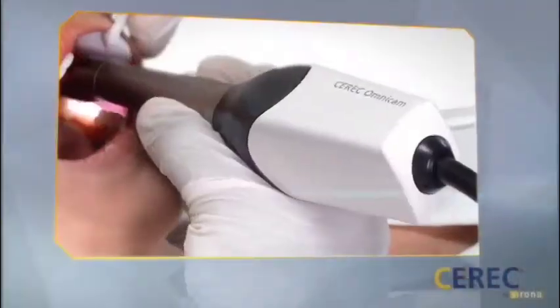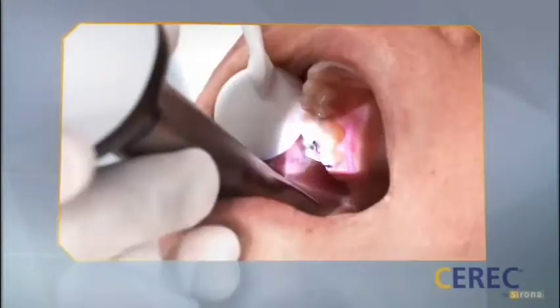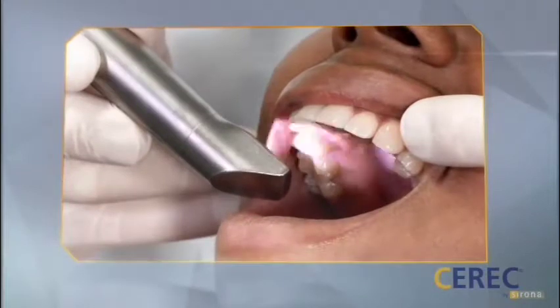Well, CAD CAM stands for Computer-Aided Design and Computer-Aided Manufacturing. It is by no means a technology exclusive to dentistry. It's used in a lot of different industries, but for the most common dental application, we are able to take a tooth that we just prepared, like say for a crown, for example, and we take three-dimensional images of that tooth. From those three-dimensional images, we can go to a computer monitor and we can actually design the restoration on the computer. And from the design that we do on the computer, it will then get milled out of a solid block of ceramic material, and that's a restoration that can actually just be placed directly in the tooth at that point.